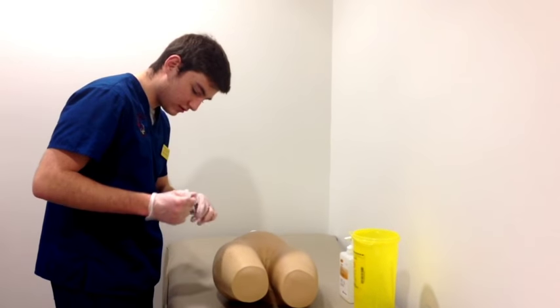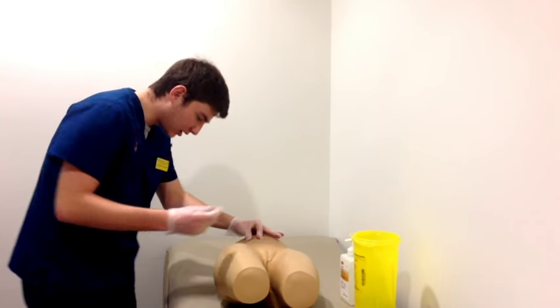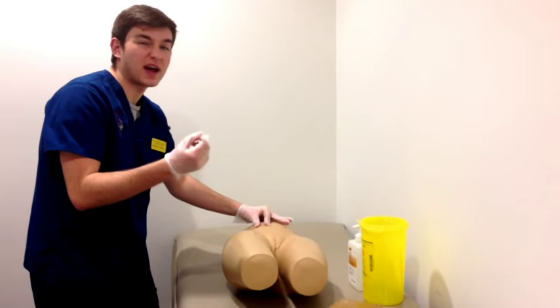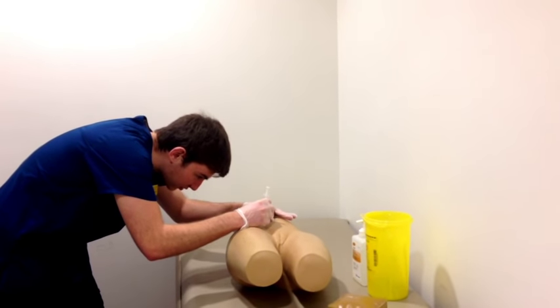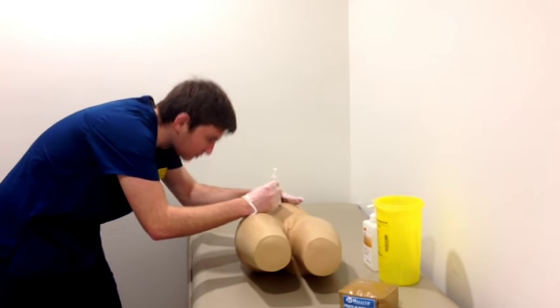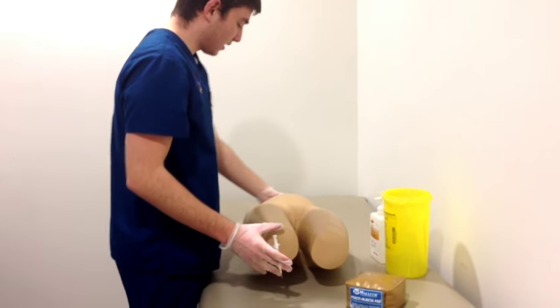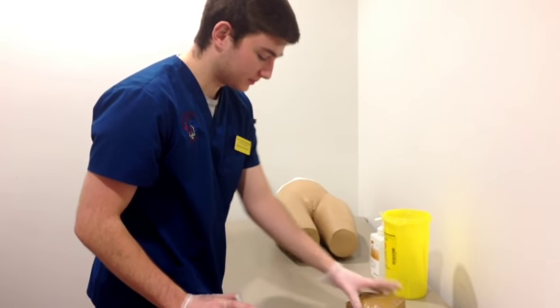I'm just going to take off the sheath. And I want to pinch the skin here. I just want to see that the needle length is around half the size of the pinch, just to make sure to see proper length. It's not going to go too deep or too superficial. So here for the picture of this patient's fine. I'm going to move it outwards. I'm going to be using this as my demonstration.